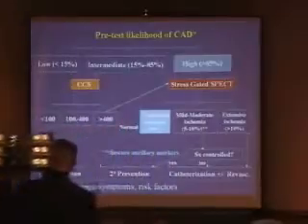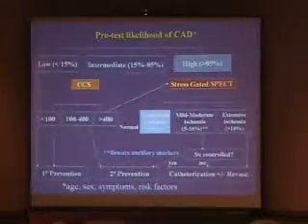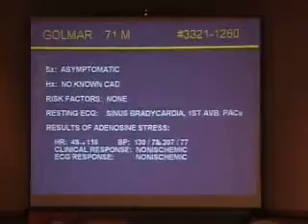So what we now believe is that if you had enough indication to go for a nuclear scan in the first place, and the scan is normal, that instead of stopping there and giving the patient a clean bill of health, going for a coronary calcium score afterwards to determine how the patient should be managed makes sense.